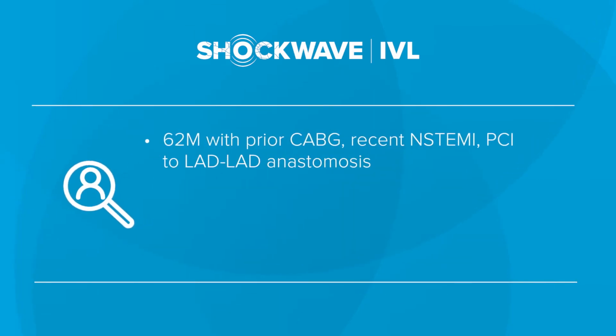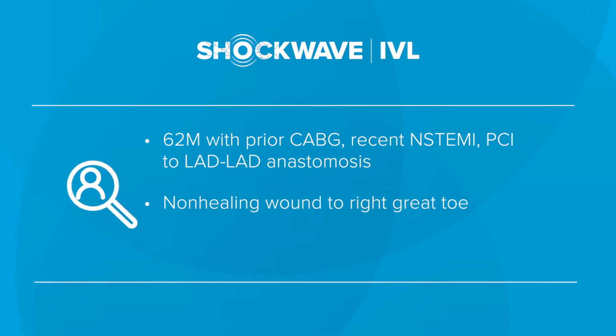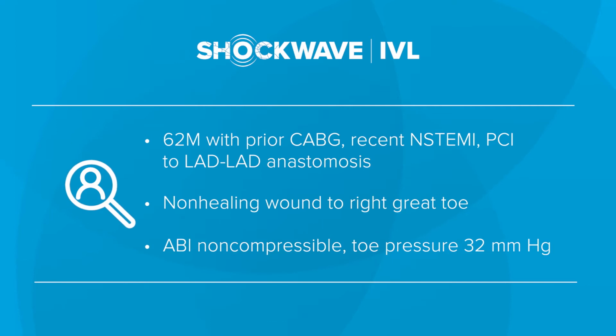The first case I'd like to share is a 62-year-old man with a prior history of coronary artery bypass graft. He had a recent non-ST elevation MI with a PCI to the LAD anastomosis. The patient had developed a non-healing wound to his great toe, and his ABI was non-compressible, consistent with severe peripheral calcification of his lower extremities, and he had an associated toe pressure of 32 millimeters of mercury. So based on these findings of a non-compressible ABI, the non-healing wound, and the low toe pressure, we proceeded to an angiogram.